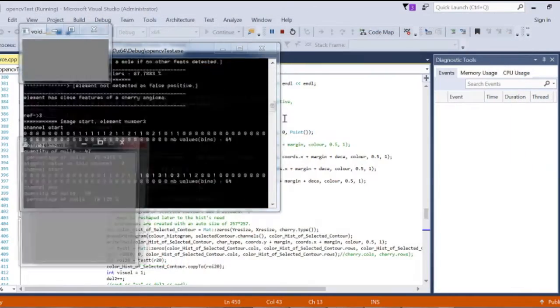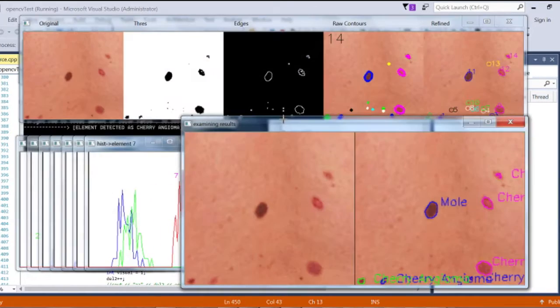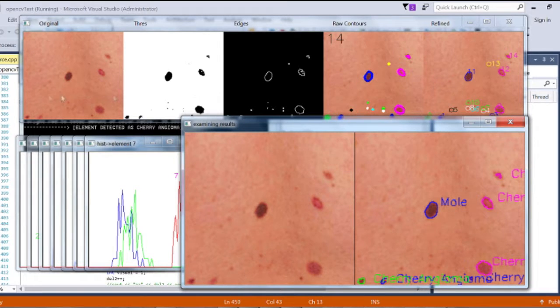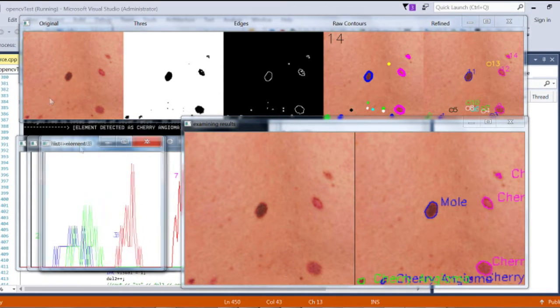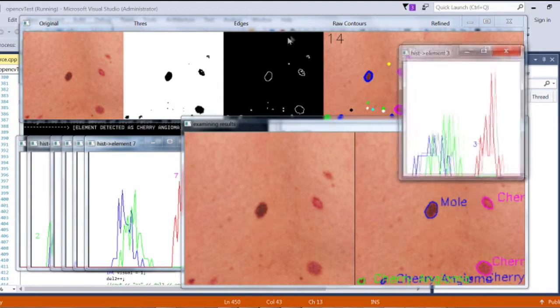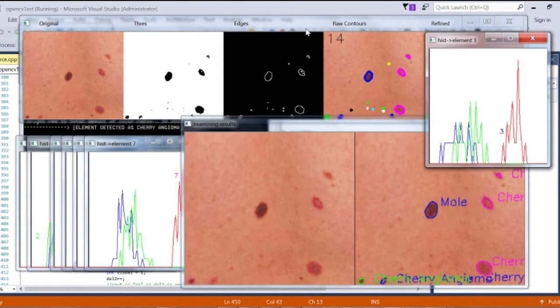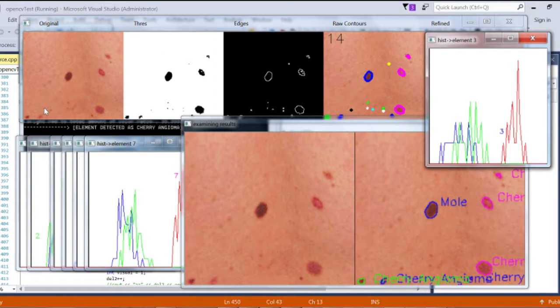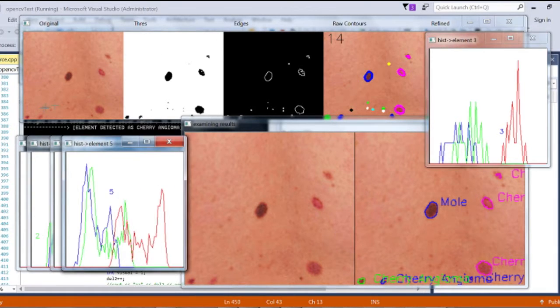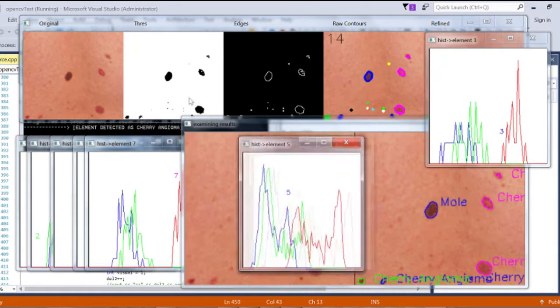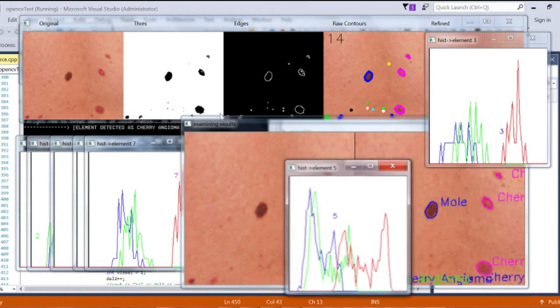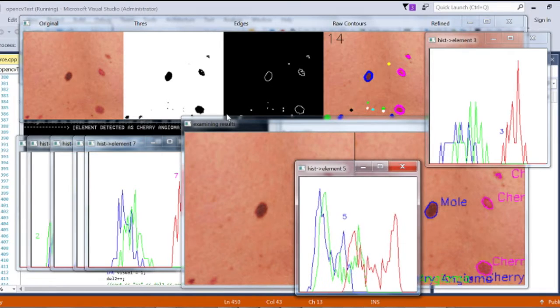The colorimetry of each extracted element is the first and most obvious and successful feature to identify its nature. Notice the difference between a mole and a cherry angioma color profile.